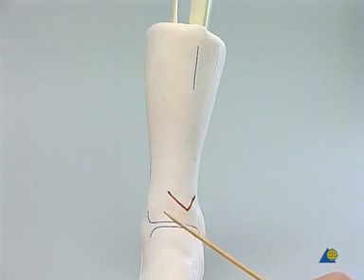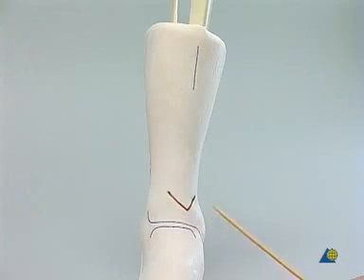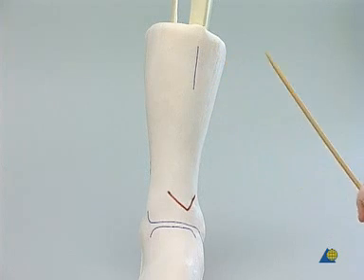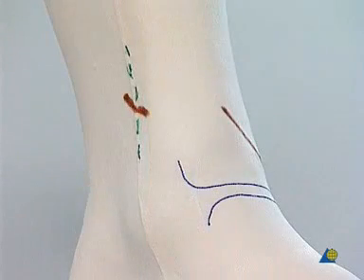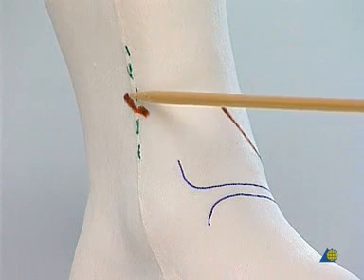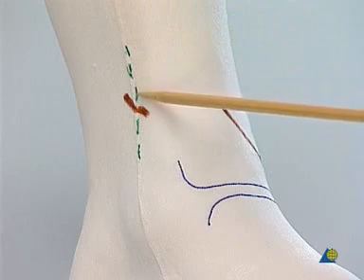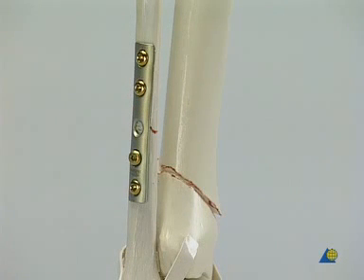The landmarks to be identified by palpation are the joint line of the ankle, the medial malleolus, the tibial crest, and the tip of the displaced proximal fracture fragment. The undisplaced fibula fracture may be fixed with a one-third tubular plate to increase stability and reduce pain. The level of the fracture and the rather posterior straight incision are indicated. The fibula has been stabilized with a five-hole one-third tubular plate, although this step is not part of the exercise.